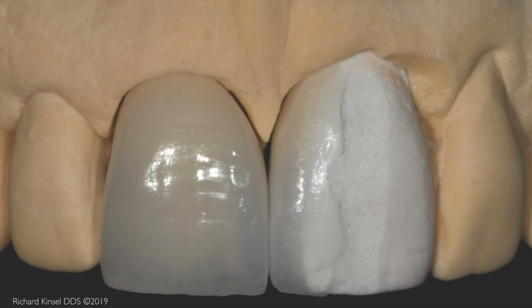The final porcelain crown is shown on the left, and the partial porcelain veneer on the right. Again, the wavy edge helps disguise the junction between the porcelain and the natural tooth.